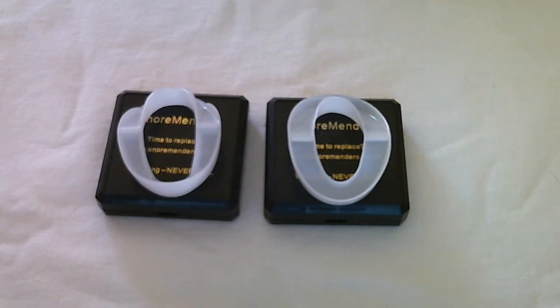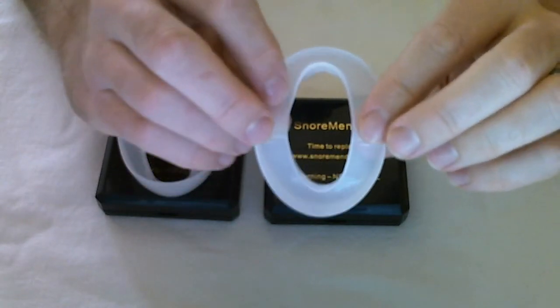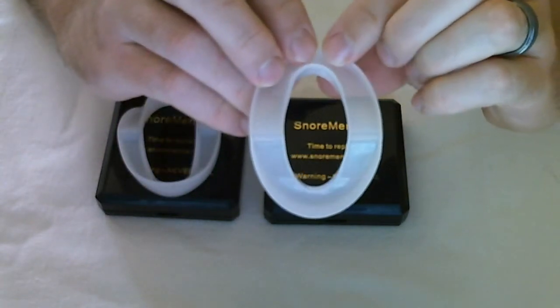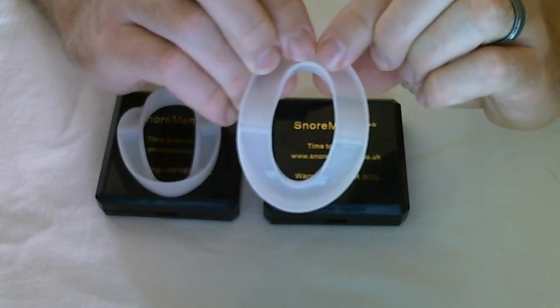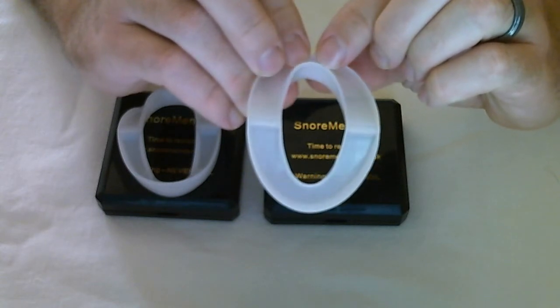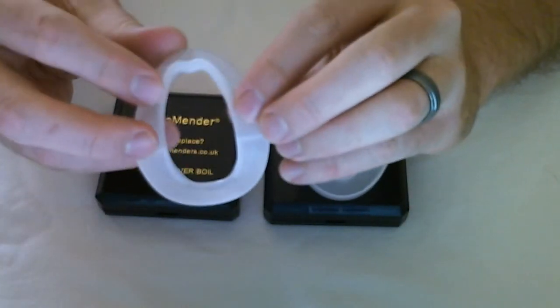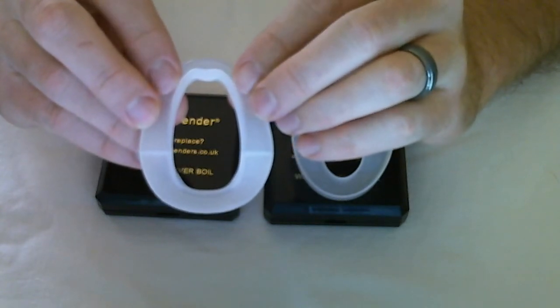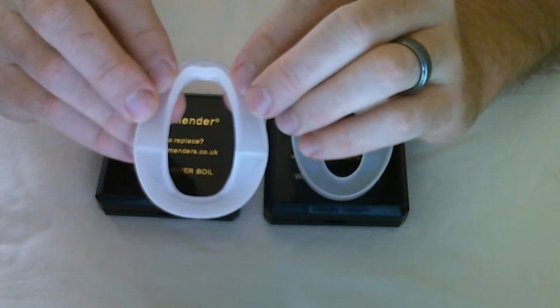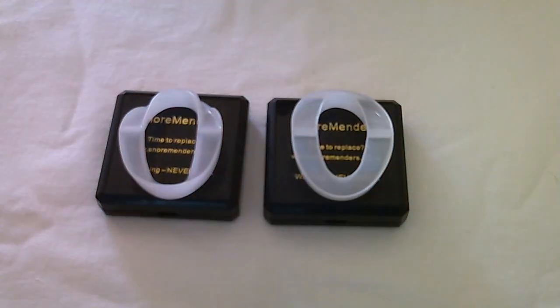Perhaps one of the most notable design changes has to do with the lower tray. This is the original, and with the original, most of the pressure on the lower tray is going to be right here in the very front of the device on these lower front teeth, and it also pushes against the upper portion of the lower teeth. With the newer design, it was reshaped and the pressure actually goes off to the sides here on these teeth, and also it pushes on the lower portion of the teeth, so that's an improvement as far as where the pressure is applied. As you can see, there's a bit of difference between the original model and the newer PS model.